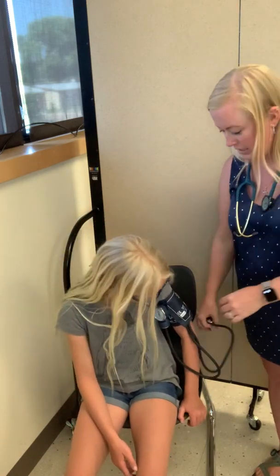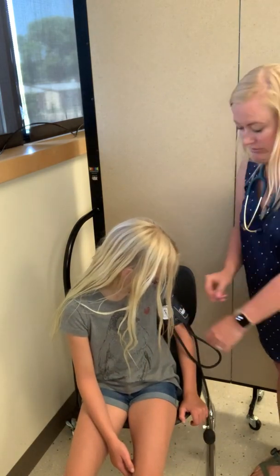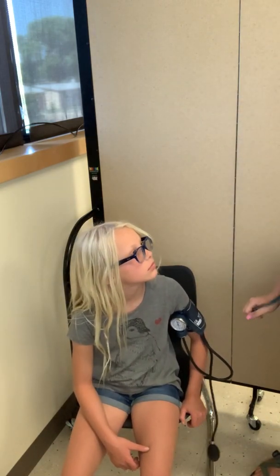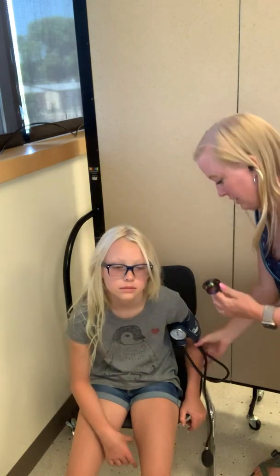I'm going to close the valve — righty-tighty, lefty-loosey on the air valve. I'm going to make sure that it is indeed at the zero position before I pump her up. Abigail, I'm just going to give your arm a little hug here. Is that okay? So you want to ask permission to make sure that it's okay and that the patient knows what will be happening during the vital setting.